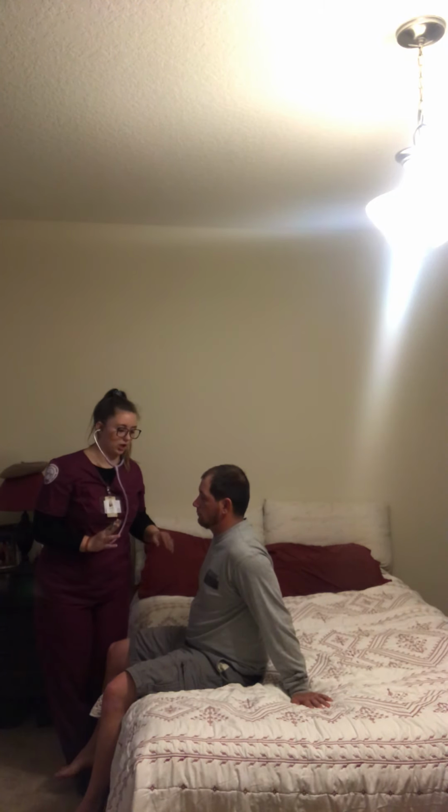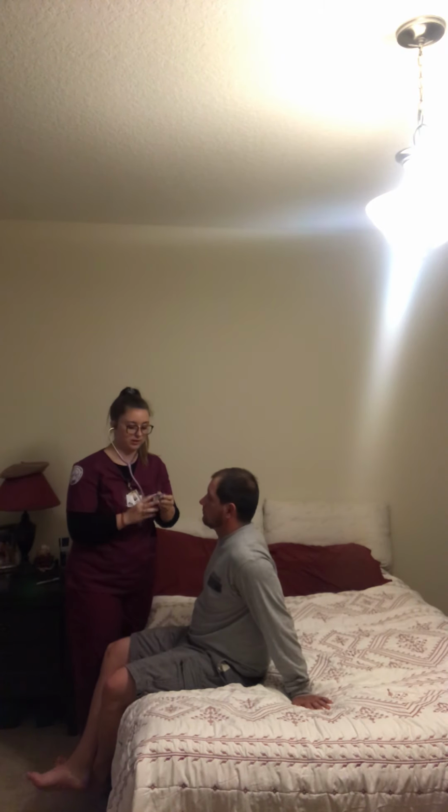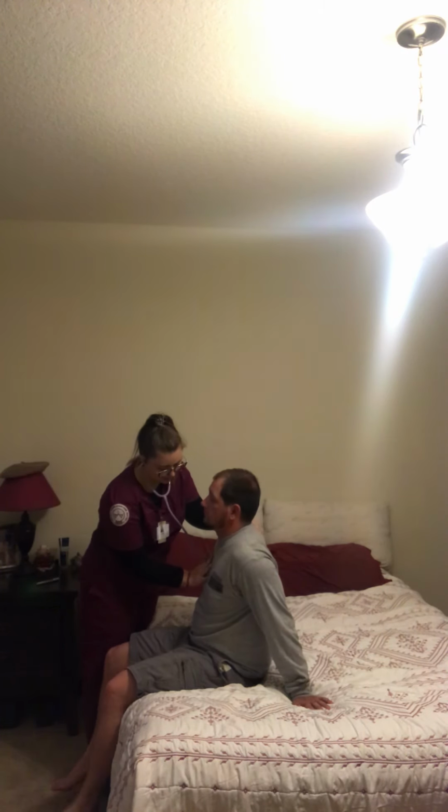I'm first going to start with the aortic valve. I'm going to listen both with the bell and the diaphragm. This is the aortic valve. S2 is louder than S1. This is the second intercostal space on the right side. I'd move over to the left side. This is the second intercostal space. This is the pulmonic valve. And S2 is also louder than S1.